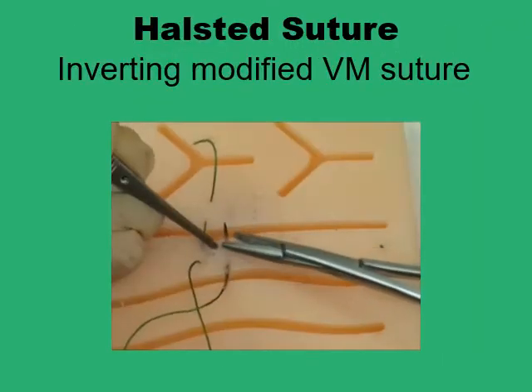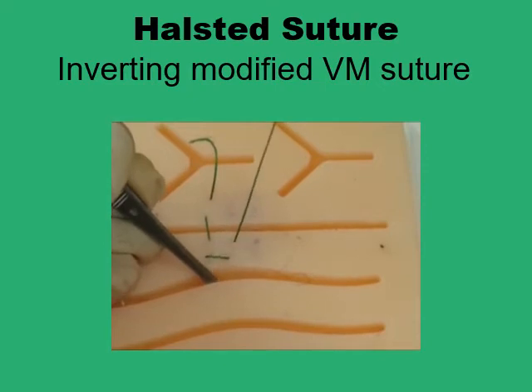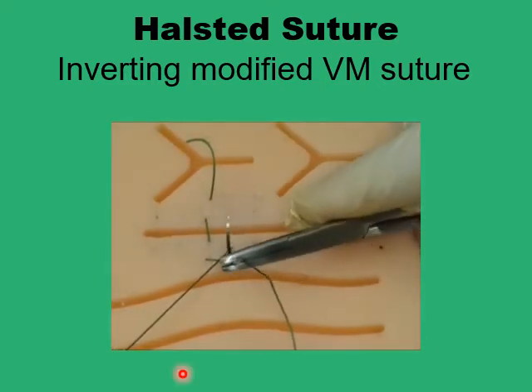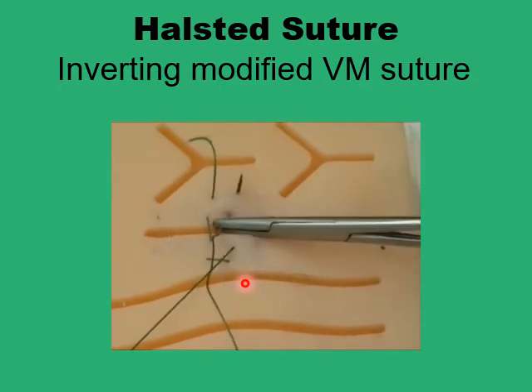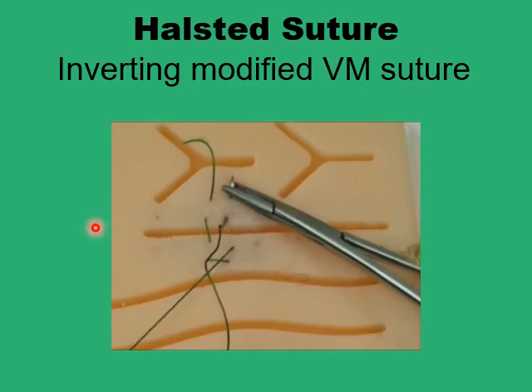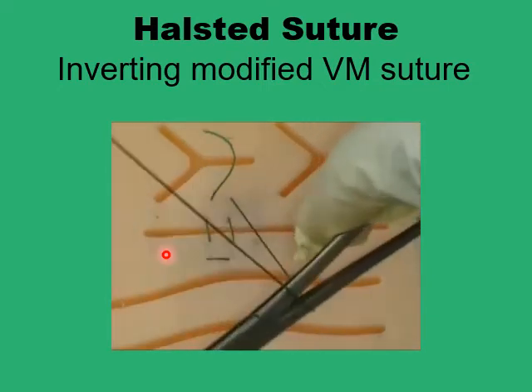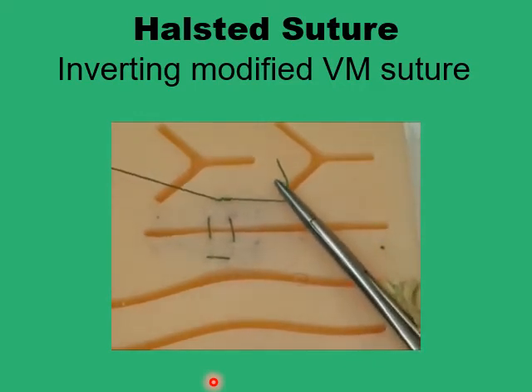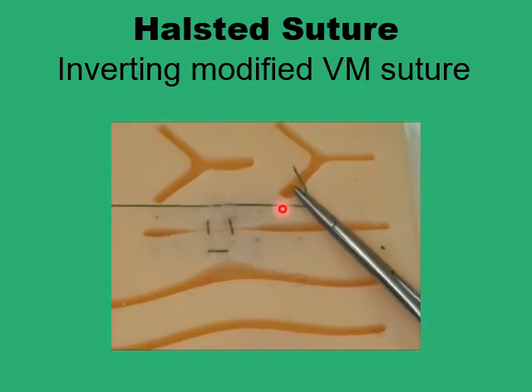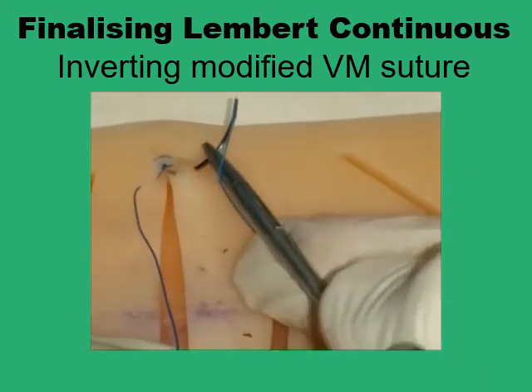The Halstead suture is a double suture formed up of two vertical mattresses. You pass the first vertical mattress from far to near, near to far, then reverse the needle and do the second line of the Halstead, forming two parallel vertical mattresses connected together like a horizontal mattress. You can then just tie on that to finish up the line, and if you want to do it as a continuous line you just go on and do more units.